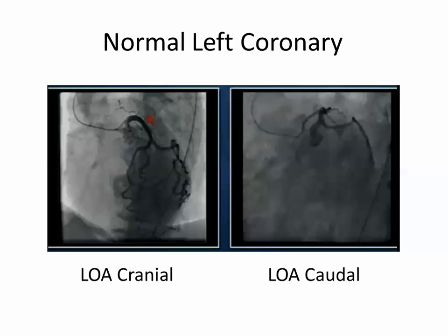What's this view? This is the shaft, so this is the spine, so this is the aorta. So the direction of the ribs will be in this direction, so you will catch the ribs and the spine by putting your left hand. So this is LAO. LAO cranial or caudal? This is the diaphragm, so it's cranial. So what are the walls?